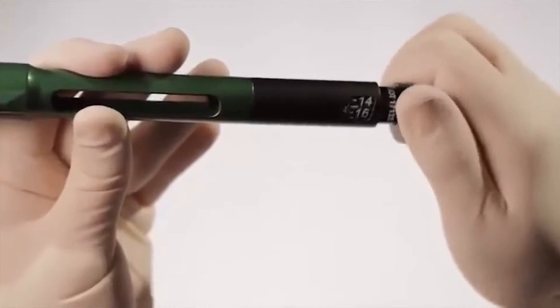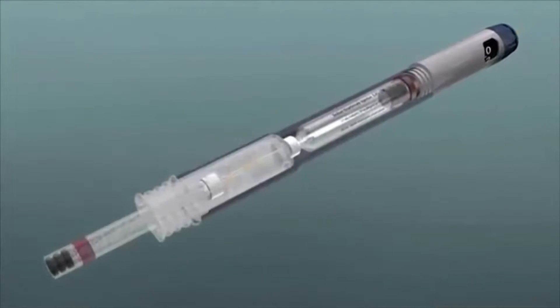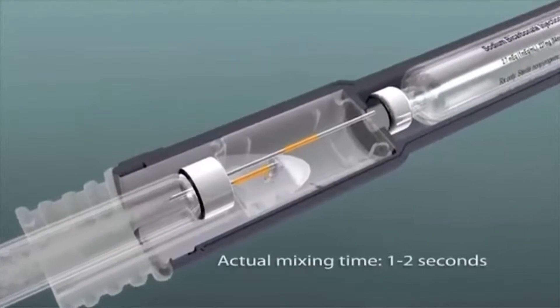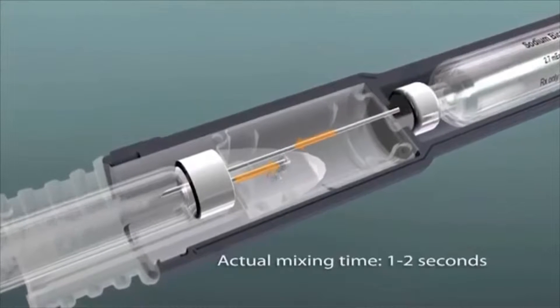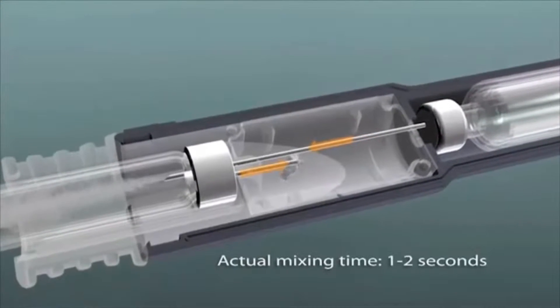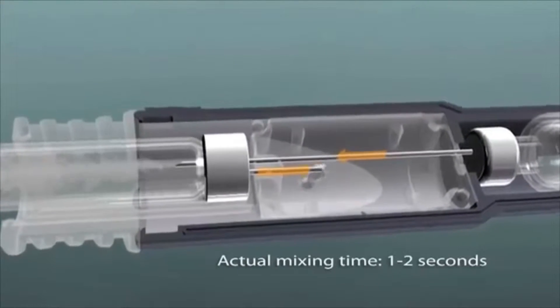The mixing pen has a precision volume dial for dispensing solution at a microliter level. The positive pressure achieved by pushing the dispensing button not only moves fluid from one cartridge to the other, it also simultaneously pushes excess fluid from the 1.8-milliliter cartridge to a holding reservoir.